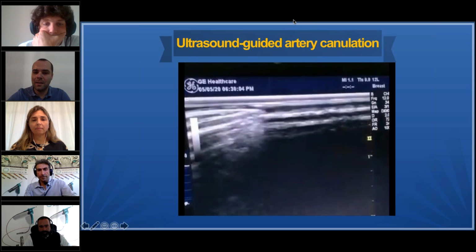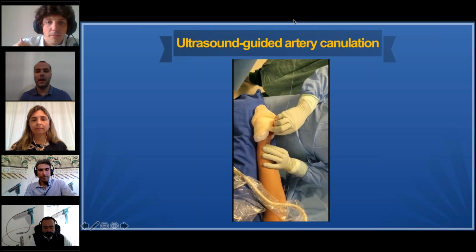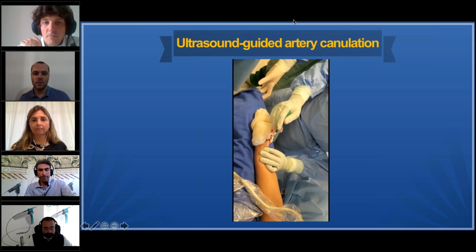As long as the needle is inside the artery, I push a little bit more to stick the needle in the skin and not lose the guide wire. In this image, you see I'm passing the guide wire through the needle, and afterward I'm passing the 6-French introducer.